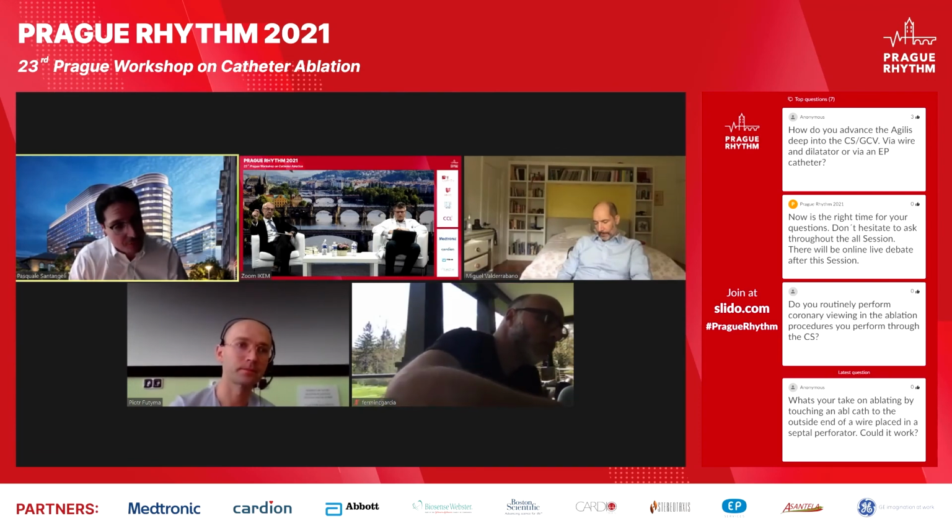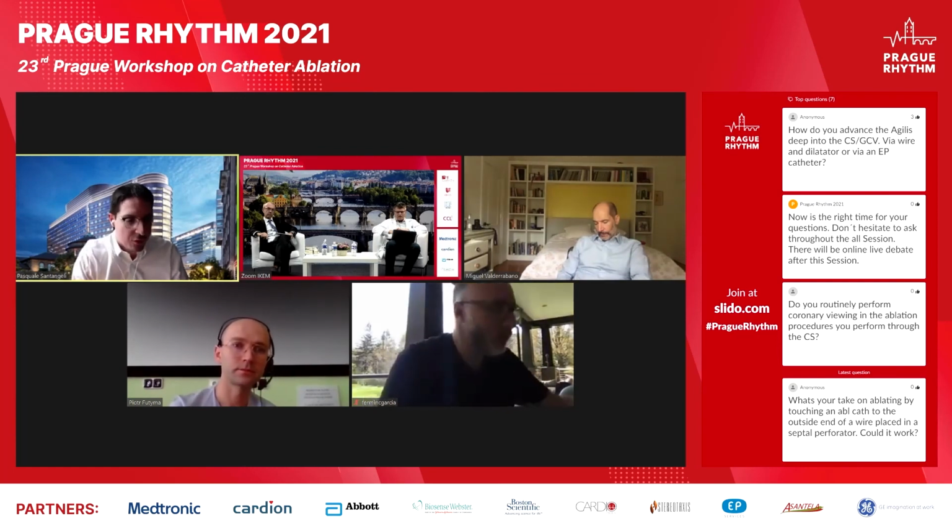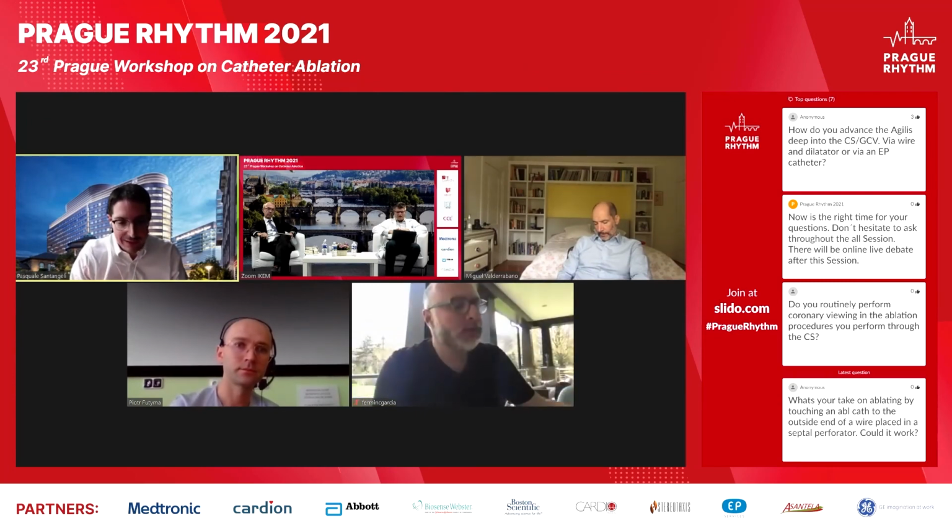Not necessarily up front though, because again, sometimes you can achieve non-inducibility also by targeting the endocardium. Of course, if you find normal voltage, by that I mean normal substrate and activation in the endocardium, and no good targets, we go right away to the epicardium. But very rarely we do it up front, unless we know that it has been ablated already by us endocardially and has recurred. And in those cases, we do epicardial up front.